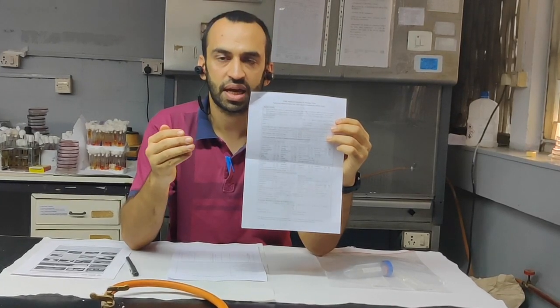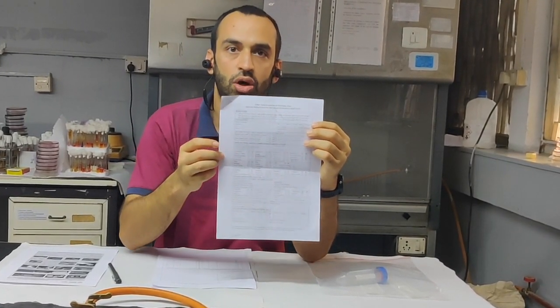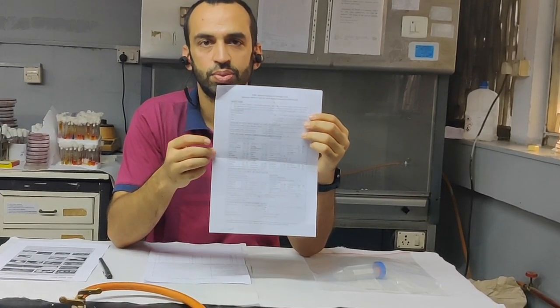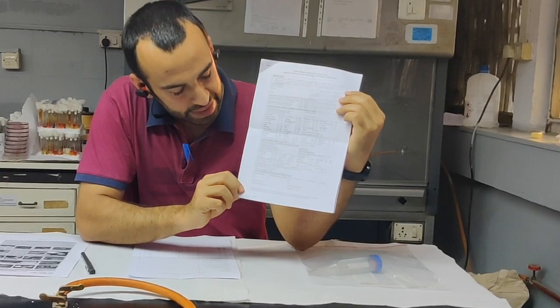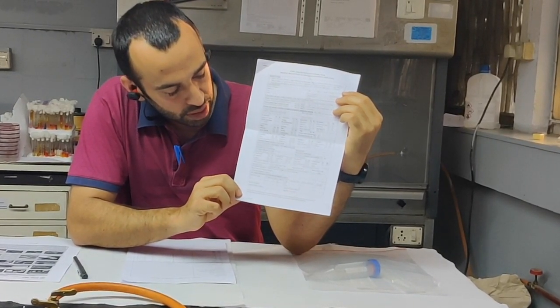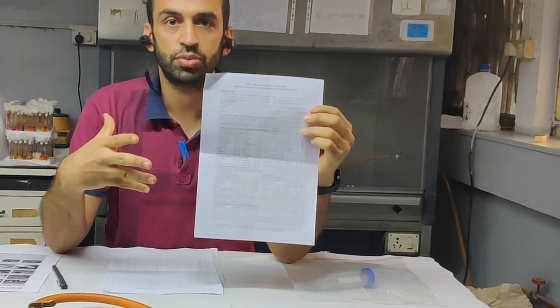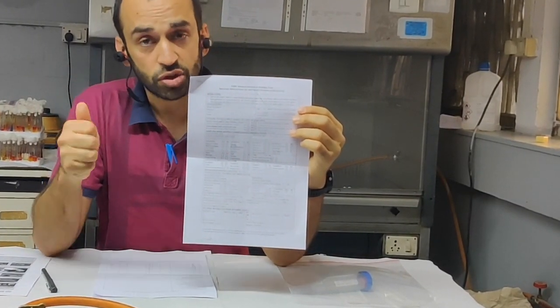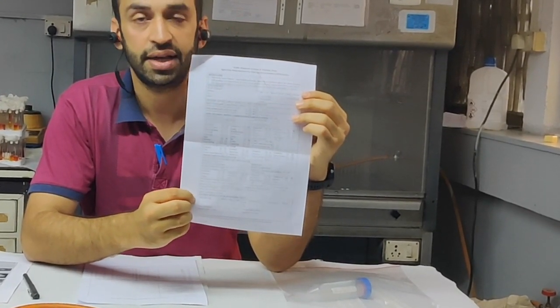So whenever you are filling a form for a patient of COVID-19 and giving samples with it, you have to fill these columns very thoroughly, and these have to be sent to the microbiology lab after filling. The last column has specimen information, that is the nasopharyngeal swab, which we will be demonstrating how to collect. That nasopharyngeal swab has to be collected and the specimen information has to be mentioned here.